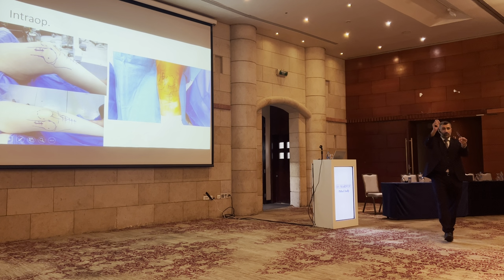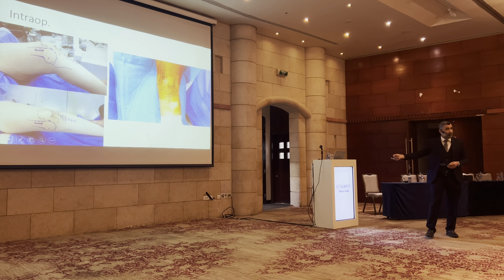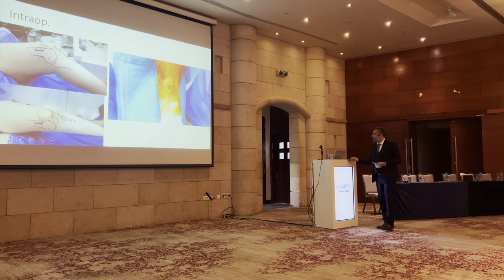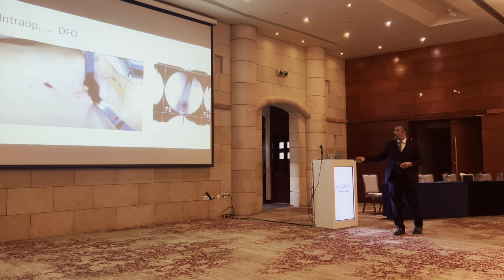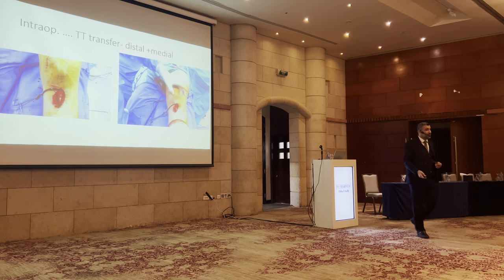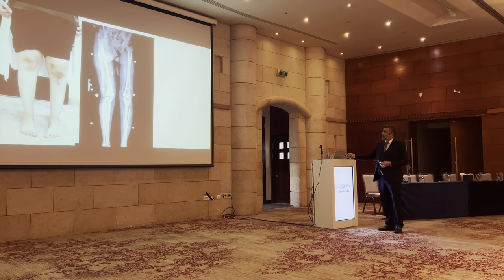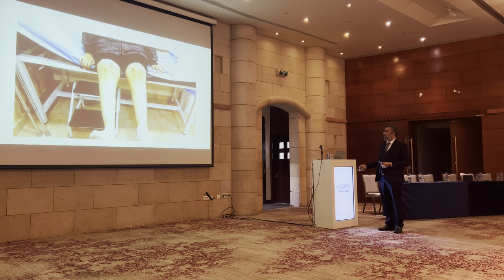So after we made the checklist plan, we decided to do a distal femoral osteotomy and tibial tubercle transfer, and after that test if the patella needs anything more. This is the osteotomy. We do a minimally invasive approach, okay? And this is after the tibial tubercle transfer. What do you think? Does she need to be open? No. And this is the patient after the operation. The alignment, the screws, and here no J-sign, no subluxation.